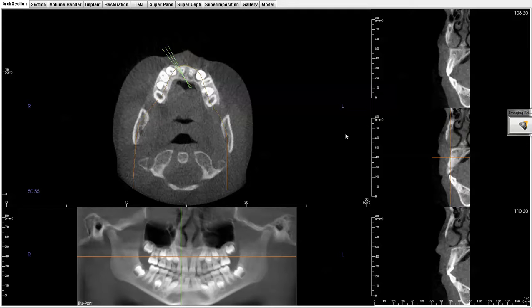Hi, this is Dr. Danielle Bauer here to review an airway analysis on the iCat cone beam X-ray machine. You can see on this first view, this bottom shot right here is the traditional two-dimensional panoramic X-ray that you would receive from an office that is using only two-dimensional technology.